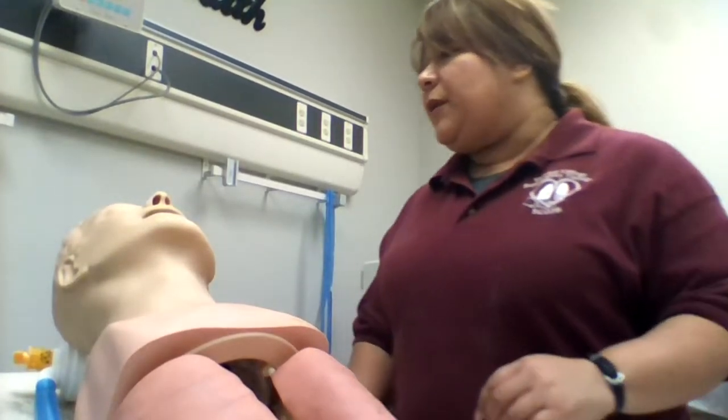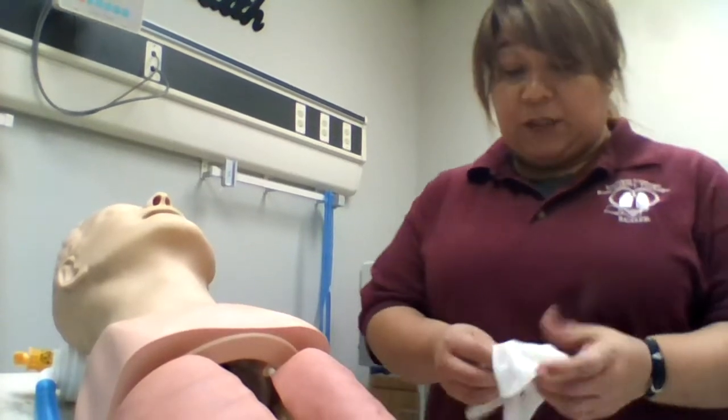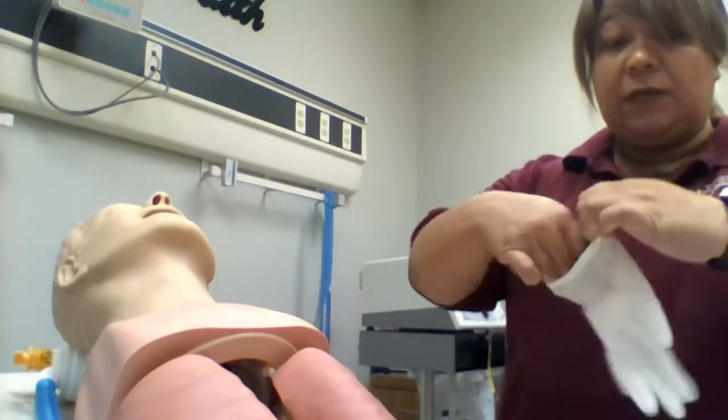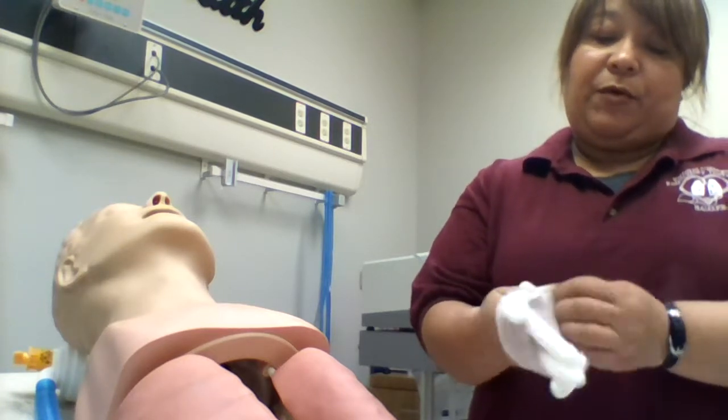Hi, Mr. Smith. My name is Veronica and I'm going to be the respiratory therapist. I'm here to educate you about keeping your nebulizer clean. First of all, let me put on some gloves. I'm going to keep it clean while we're taking it apart.